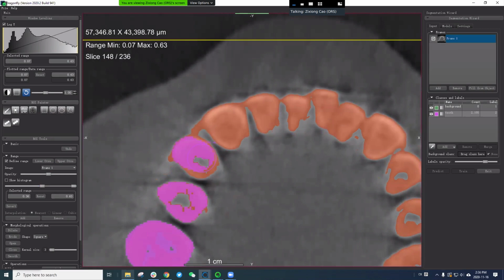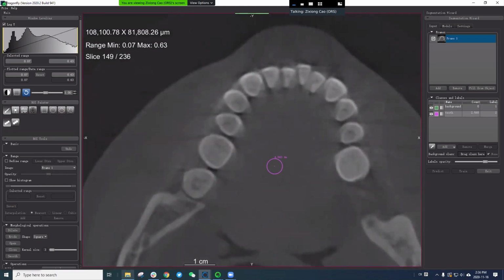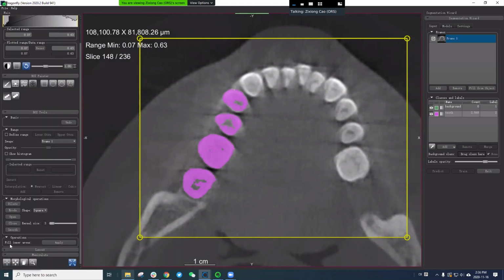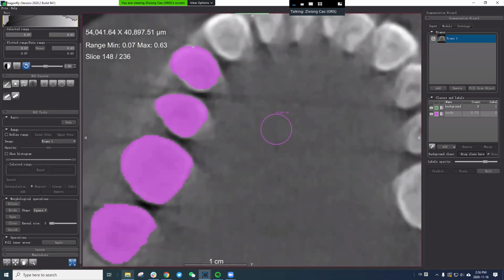If I made a mistake, I have to correct it now. Well, you can correct it later, but I show you, I did 4 of them, and sometimes we have the tool to make it faster. For example, we have a fill in the areas, because we don't want the inside area to be excluded from the teeth. We want them to be filled. So we do this filling, and this will fill all the teeth inside. But it only fills when it's a closed hole, a closed inside.